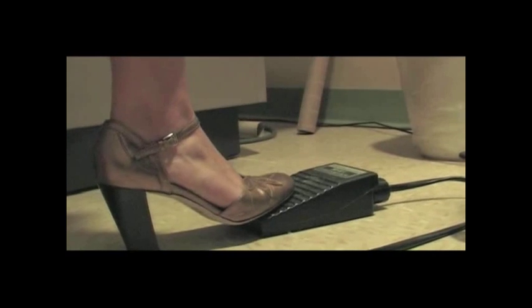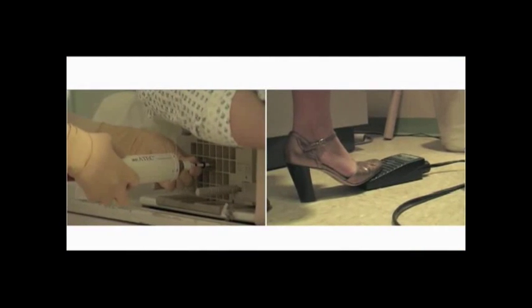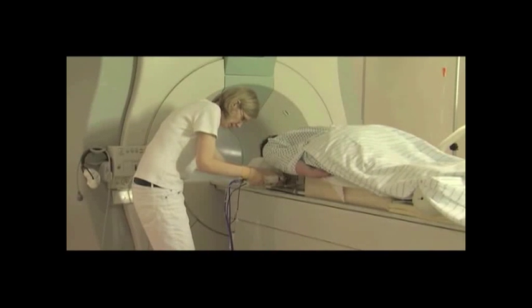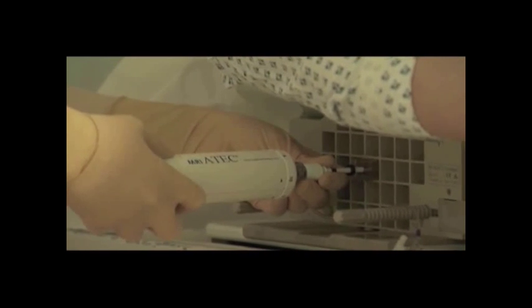Depress the foot switch to activate the biopsy system and continue to hold the foot switch down throughout the tissue acquisition sequence. Tissue acquisition occurs every 4.5 seconds. A beep indicates the end of one cutting cycle. Manual rotation of the handpiece occurs just after the beep during the resting phase of the biopsy cycle.